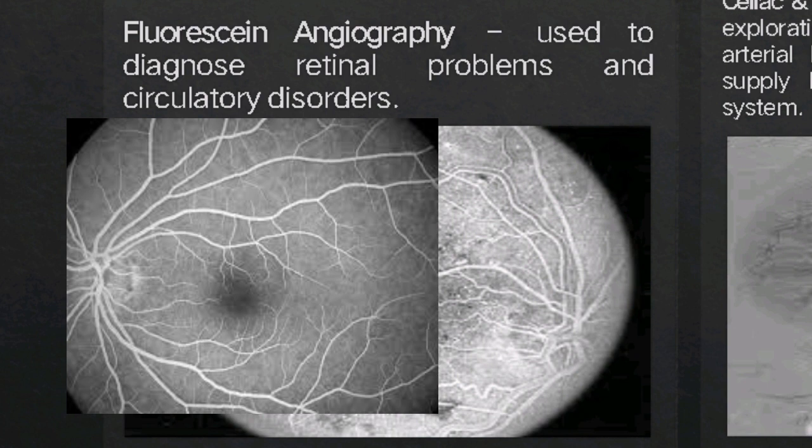The procedure does not require X-rays. Instead, a rapid series of close-up photographs of the patient's eye are taken. One set immediately after the dye is injected and the second set approximately 20 minutes later once the dye has moved through the patient's vascular system. The entire procedure takes up to 1 hour.